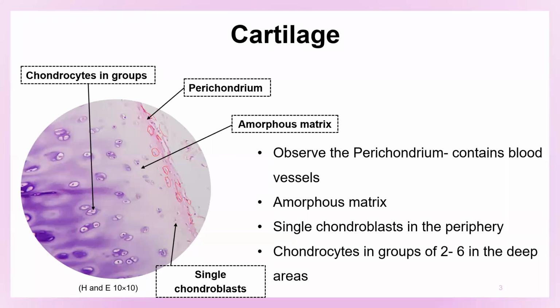The chondroblasts, you can see, are single cells. You can see the lacunae actually. What looks like the cell margin is actually the lacunae, which is basically a small tiny space between the cell and the matrix. Now this is the matrix. It looks just white, right? We call it amorphous because it doesn't have any character, so we say it's characterless.